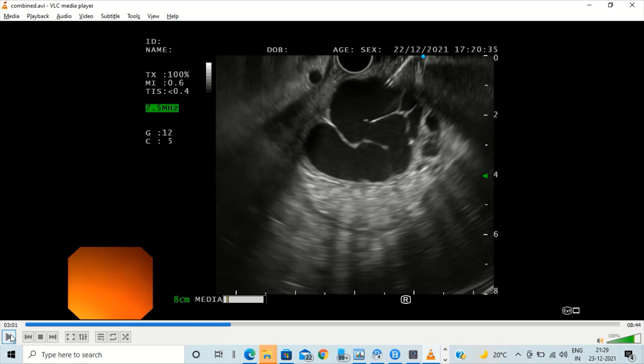Why is measuring the diameter of the varices important? Because the total diameter of the coil we insert should definitely be larger than the size of the varices, such that it does not embolize. How much larger? The literature suggests 1.2 to 1.6 times larger. Assuming the size of this varix was 3.4 cm, 1.2 times comes to around 4 cm. The largest diameter coil available to us is a 20 mm coil — 2 cm in diameter and 20 cm in length. The length is not important; what matters is the diameter. Therefore we decided to insert at least two 20 mm coils, amounting to a total diameter of 4 cm, and then see if a third coil would be required.